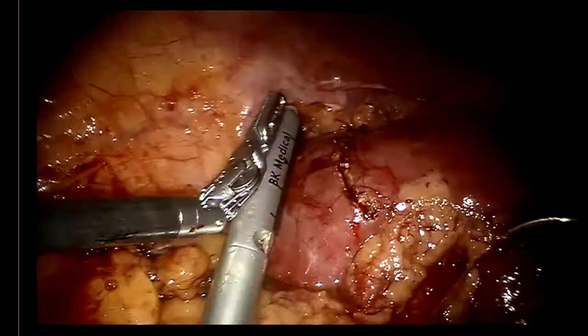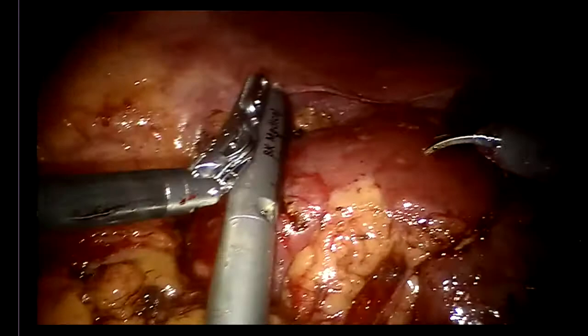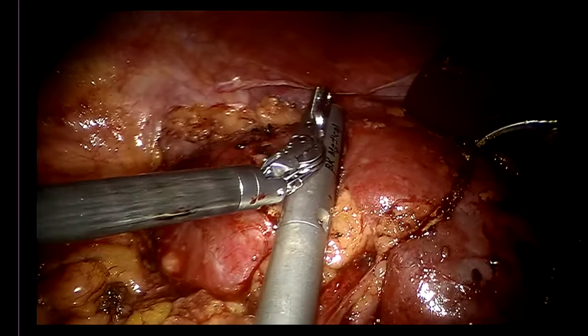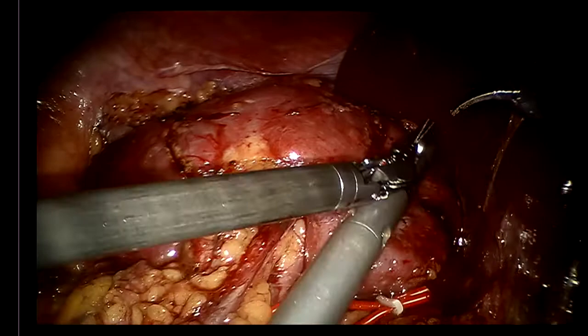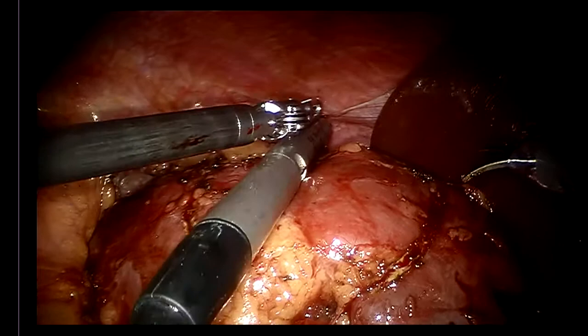Okay, so now let's check the rest of the kidney. So this is the rest of the kidney, looking nice and clean. That's the tumor, all tumor, out of the tumor now. And this is the remainder kidney, renal, that looks good. All this is cancer. Or more accurately, tumor. All right, so that should do it.